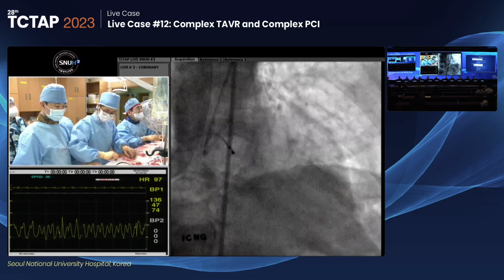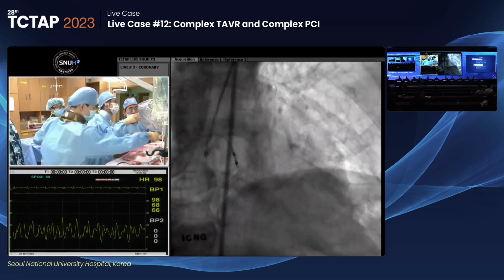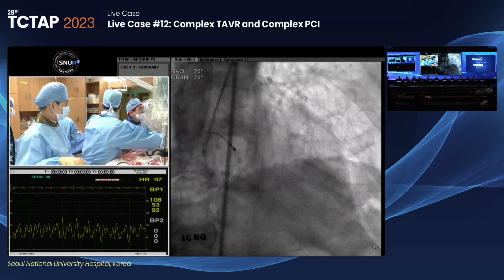Dr. Kim, what is the name of the microcatheter you are using now? Corsair. Corsair XS. Okay, Corsair is okay.